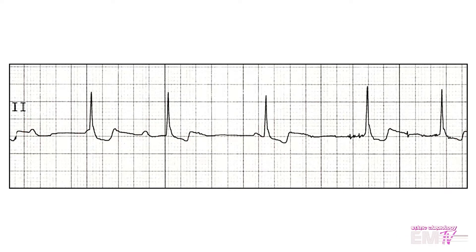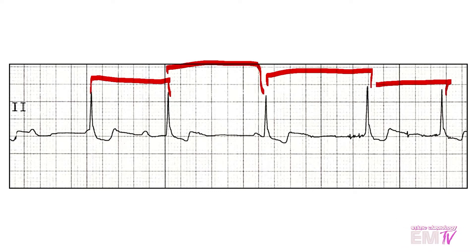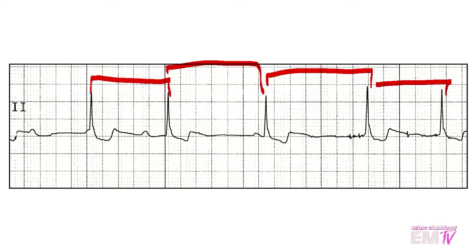Next thing I'll do is examine my R to R interval. My R to R interval here seems to be inconsistent. I'll then look at the width of the QRS complex. Despite that little slurring notch there near the S wave, this is actually a narrow QRS complex — it measures in at about 0.08, which is well within the boundaries of a normal QRS complex width.